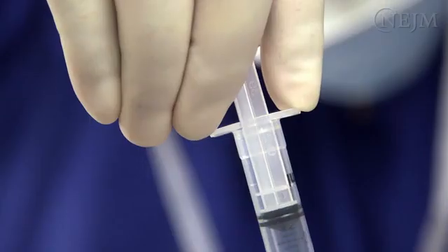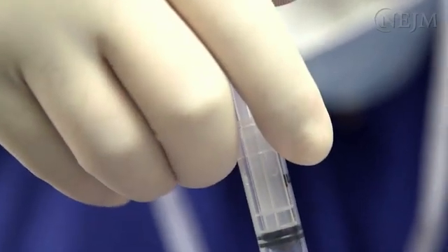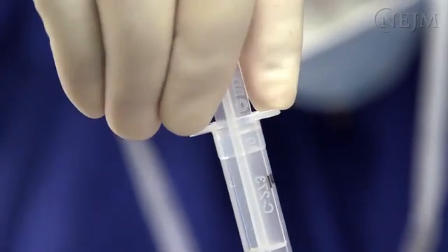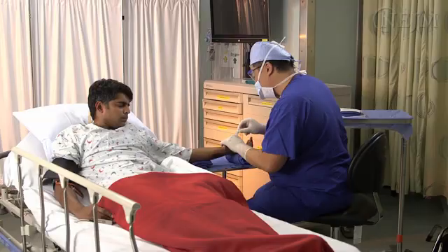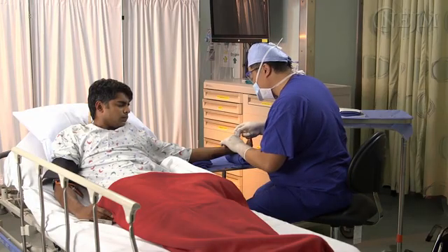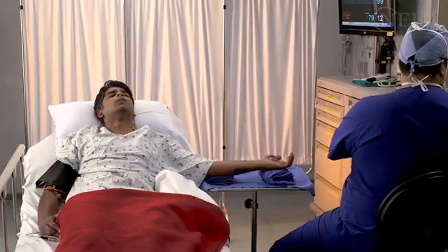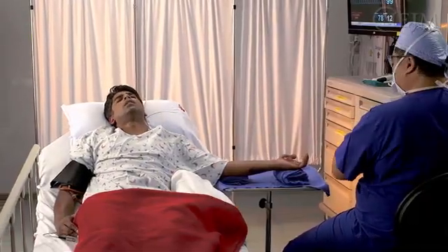Intermittently aspirate after every 1 to 2 cc's are injected to check for blood. If on injection the patient reports severe pain, a sense of electrical buzzing or shock, or pain that shoots or radiates into the fingers, the needle should be withdrawn to prevent intraneural injection. If the injection causes a subcutaneous wheal, then the needle placement is too superficial.